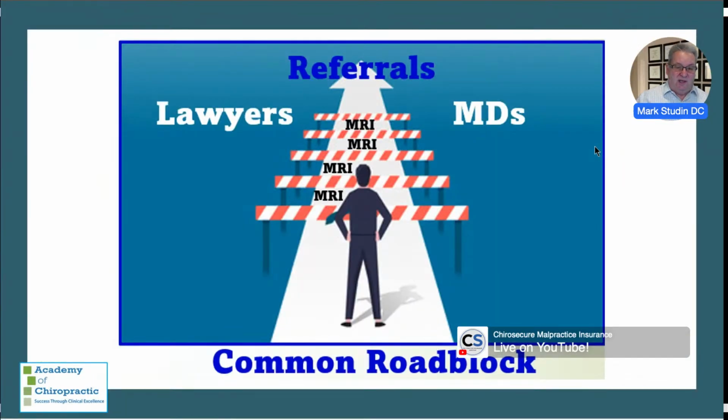So when we look at referrals, a common roadblock for lawyers and medical providers is MRIs. We have to understand what's going on. If you want that referral, you, at best, when clinically indicated, order an image. Now, the fact that the patient's in a car crash or they fell, is that an indication for an MRI? Oh, I have a lawyer. I have an MRI. If you do that, prepare to hand your license over. That is not a standard.